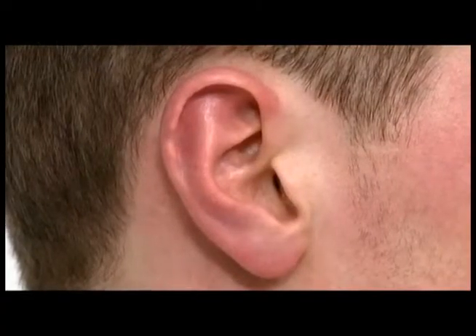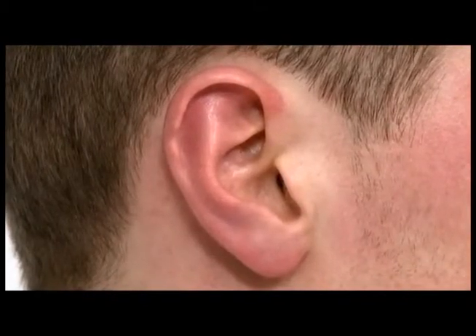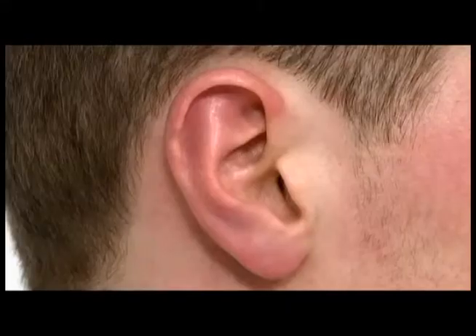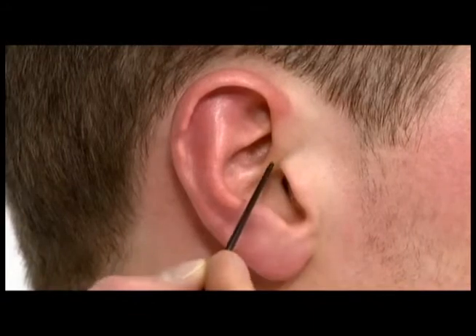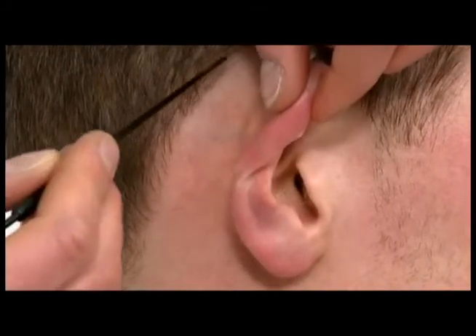So I'm now going to start by examining the better hearing ear. First, inspect the external ear, using the light of the otoscope to help. Look at the colour of the skin and the shape of the pinna. Look for other abnormalities such as tophi and congenital defects, and remember to check for scars. Common surgical scars include the endaural scar between the root of the helix and the tragus, and the post-auricular scar behind the pinna.